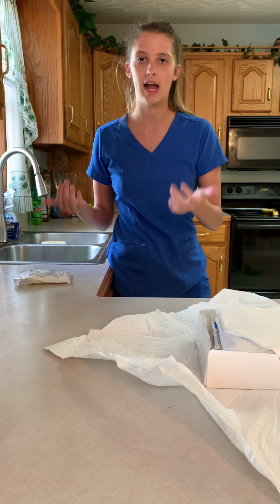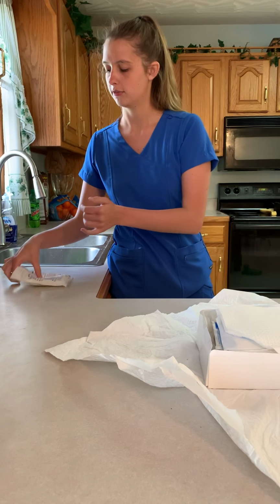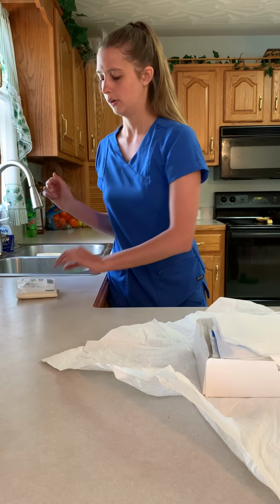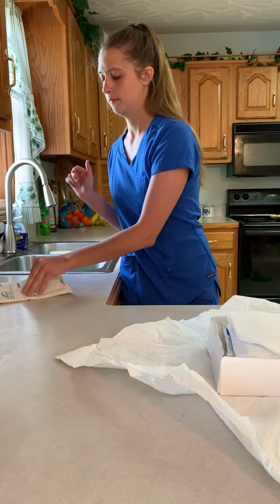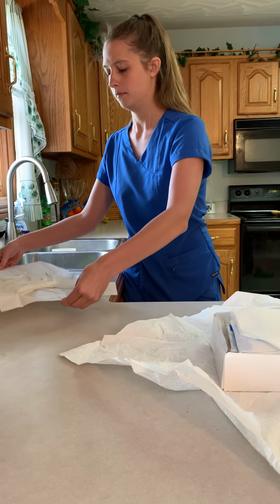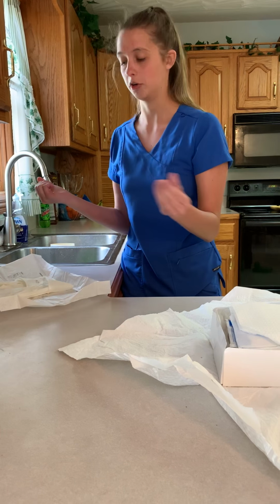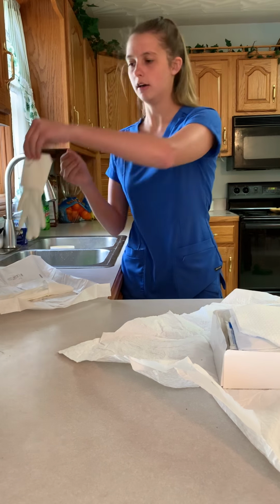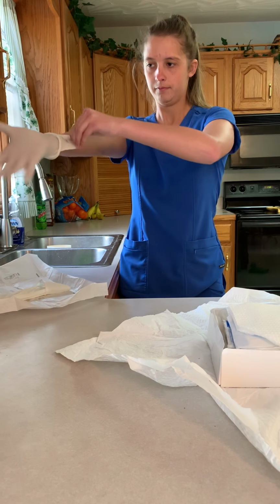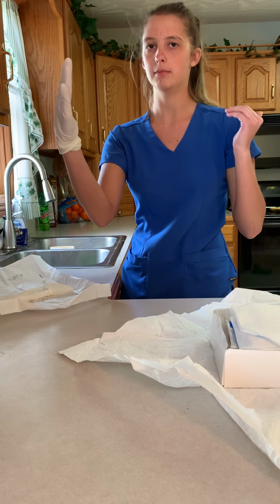So when I put on my sterile gloves, I am going to make sure that I have a table that is above my waist, and I'm going to keep my hands above my waist at all times when doing this. So first, I'm going to open up my sterile gloves. Okay, so I'm first going to pick up the cup. I'm going to hold it above my waist. Okay, again, I'm keeping it above my waist.